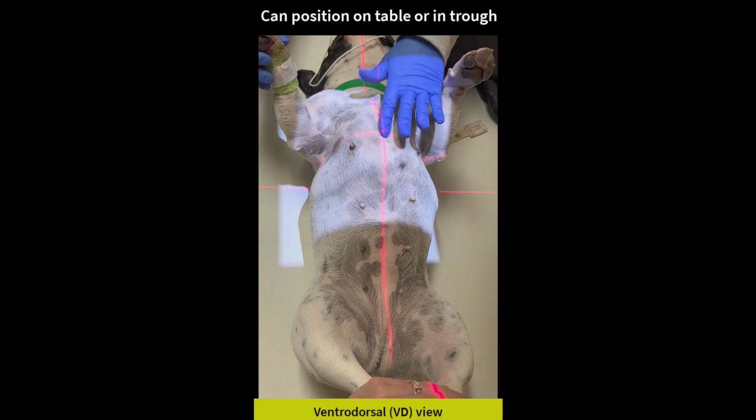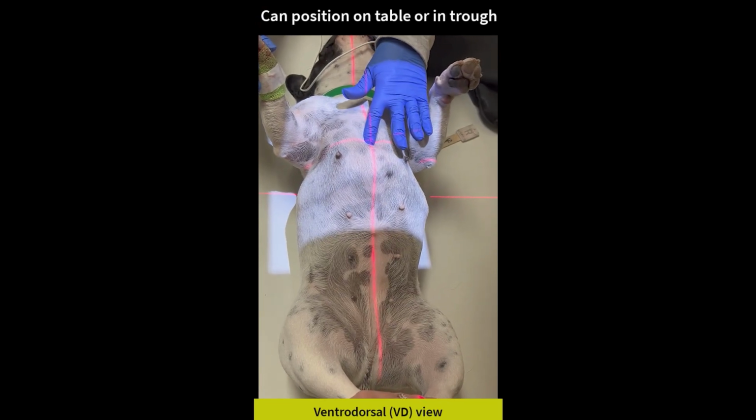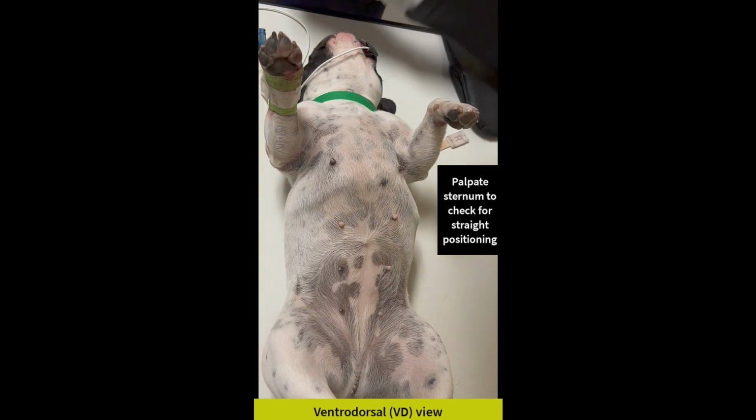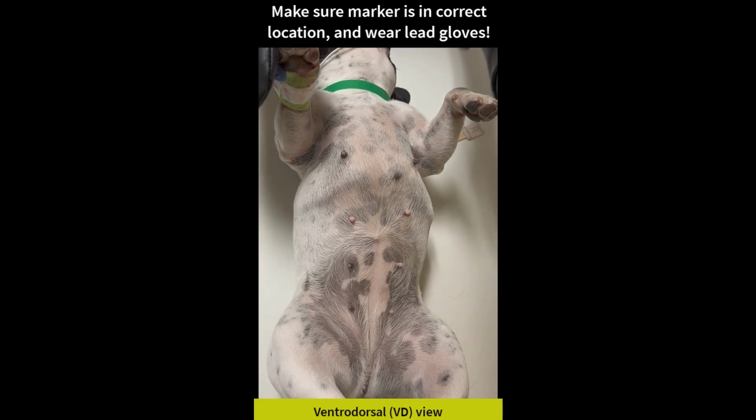Positioning for ventrodorsal radiographs is performed with the patient in dorsal recumbency, either in a positioning trough or directly upon the table. The sternum and spinous processes should be aligned with the longitudinal positioning line. Radiographic technique factors should be adjusted for the height measurement of the thoracic cavity. Ensure the marker is in the correct location.